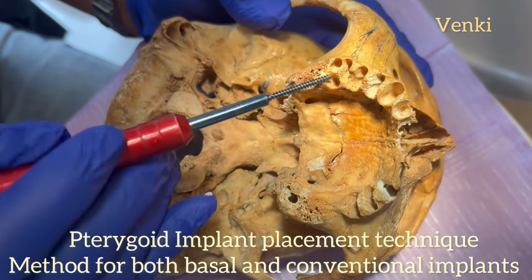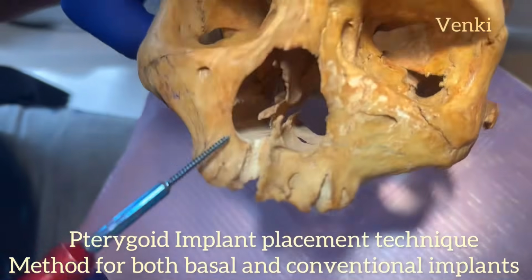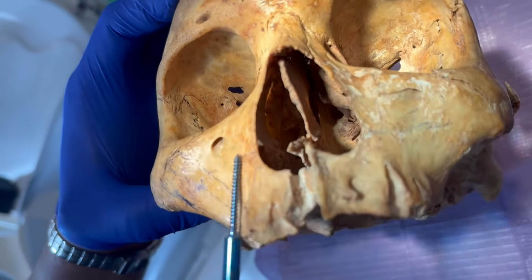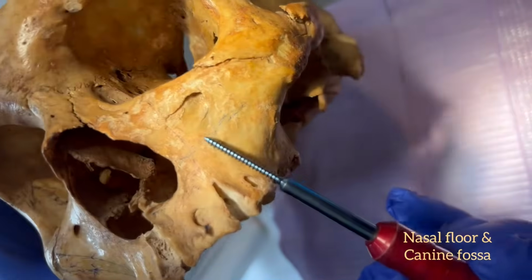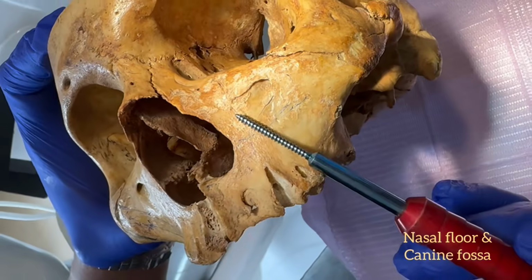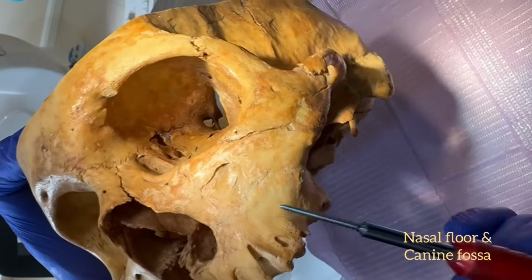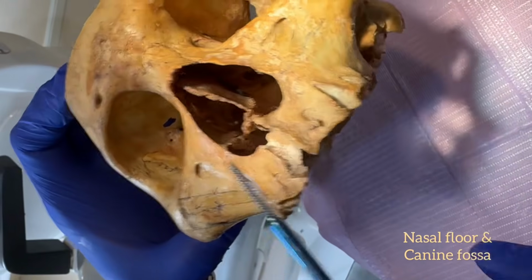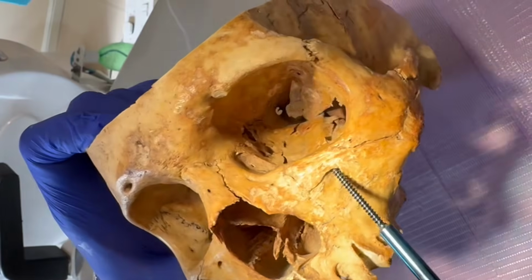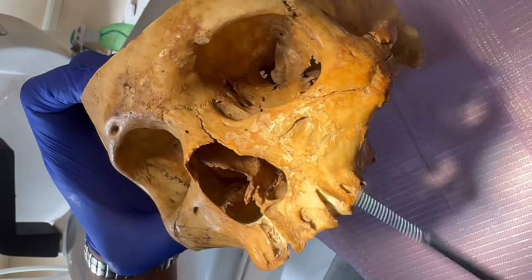So maxillary arch, maxilla, anterior portion, nasal floor region, canine fossa on these two sides. I'm just showing the anatomical landmarks where we engage our basal implants. Nasal floor, canine fossa region on either side. You can have infraorbital foramen on each side. You can say careful while placing zygomatic implants.